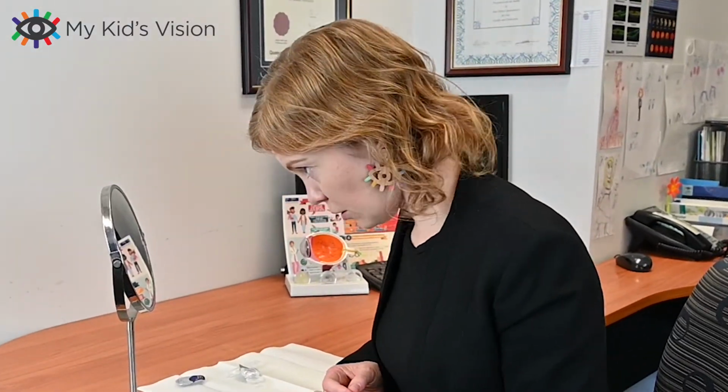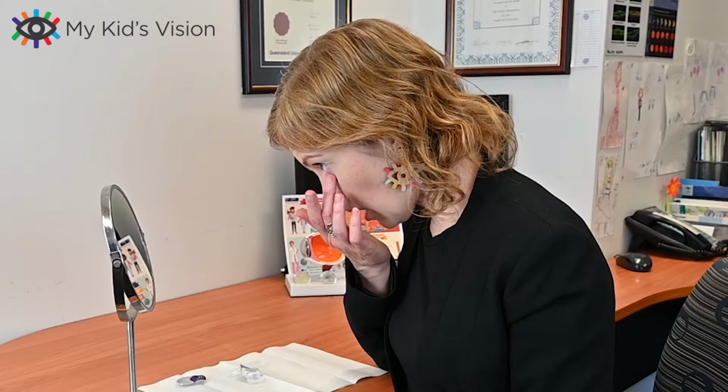Now I'll show you how to take the contact lens off. Now when we take the contact lens off, again, we want to make sure we've washed our hands with soap and water. And you can just use your writing hand, your dominant hand for this. That's my right hand for me. So we're going to go back to the mirror, tilt your chin down and look up at yourself in the mirror. And if you look at me now, you can see all of this white of my eye that we have to work with. We're going to slide the contact lens onto the white of the eye.